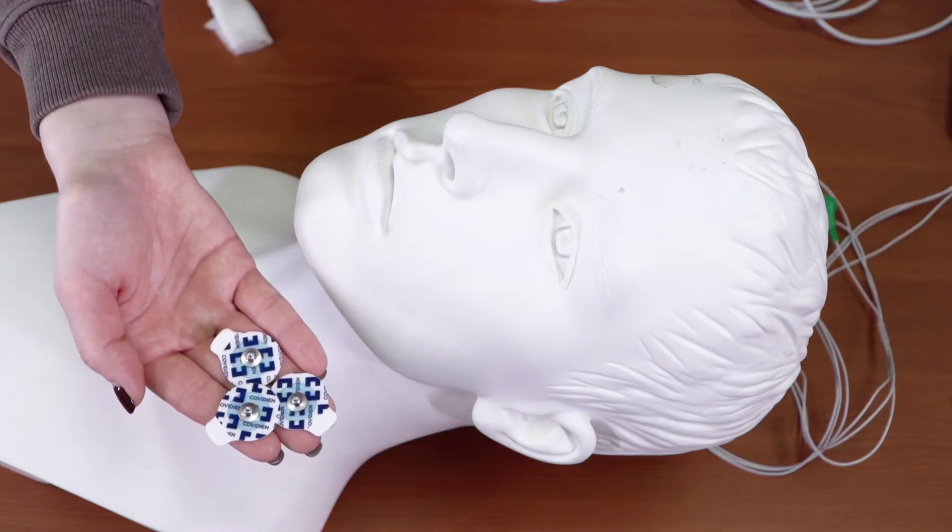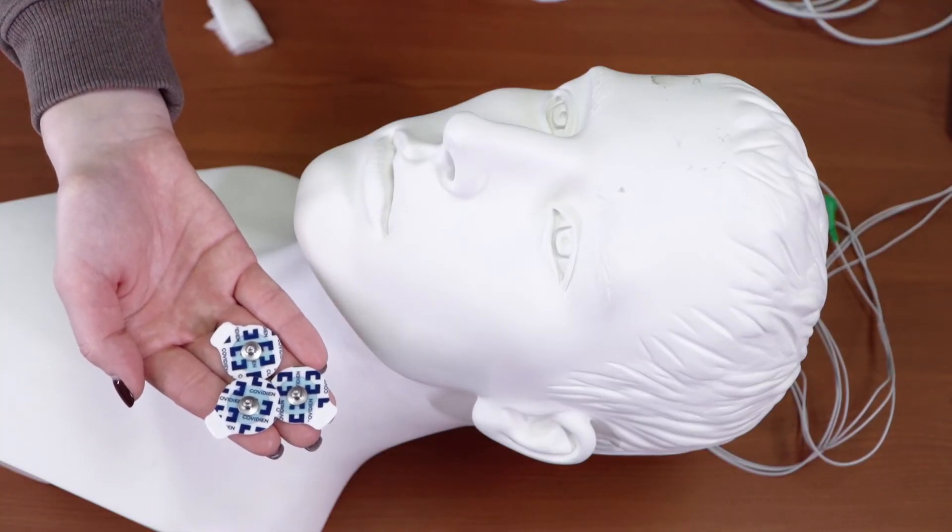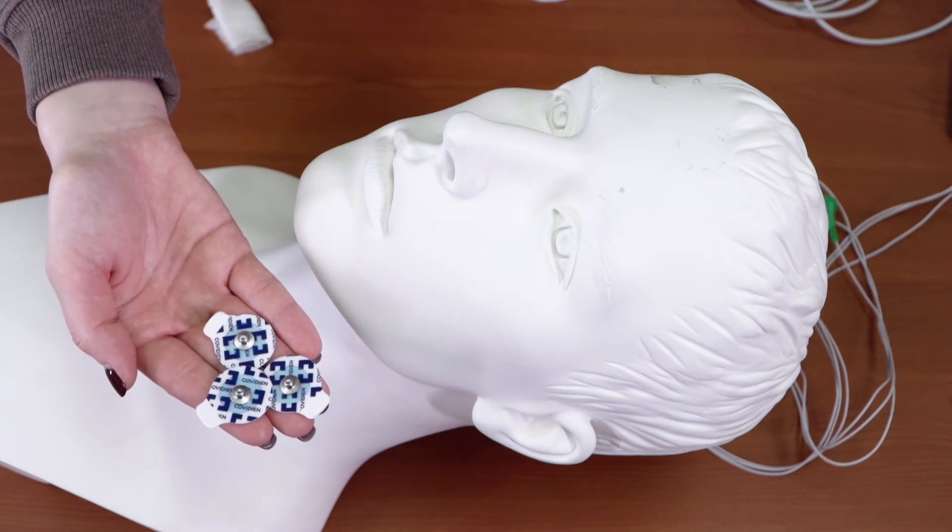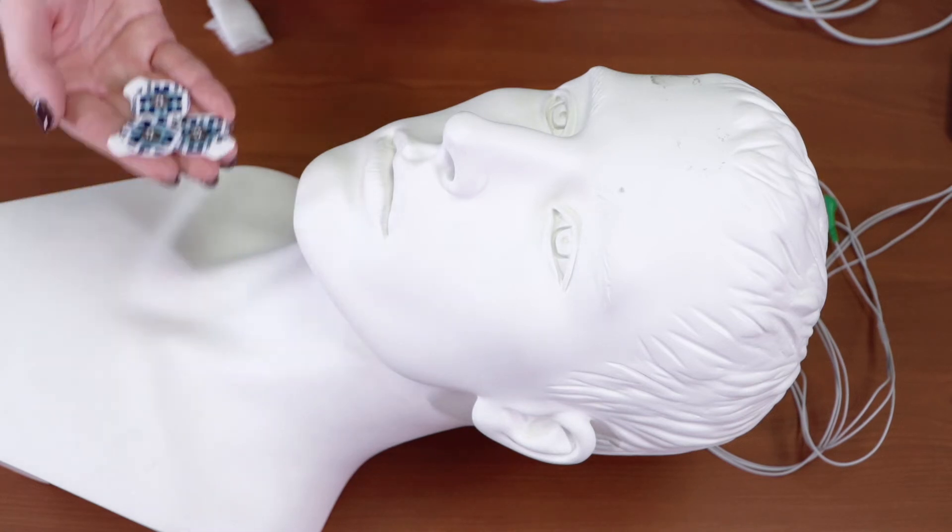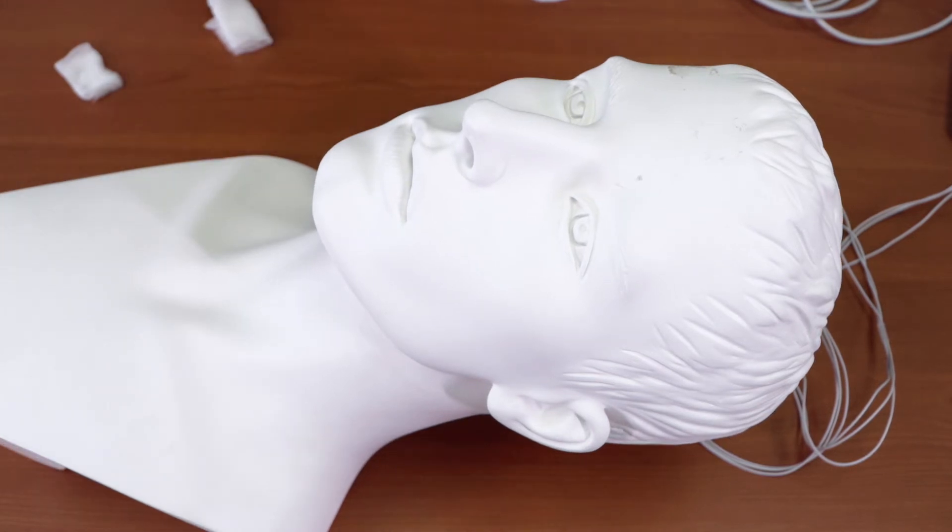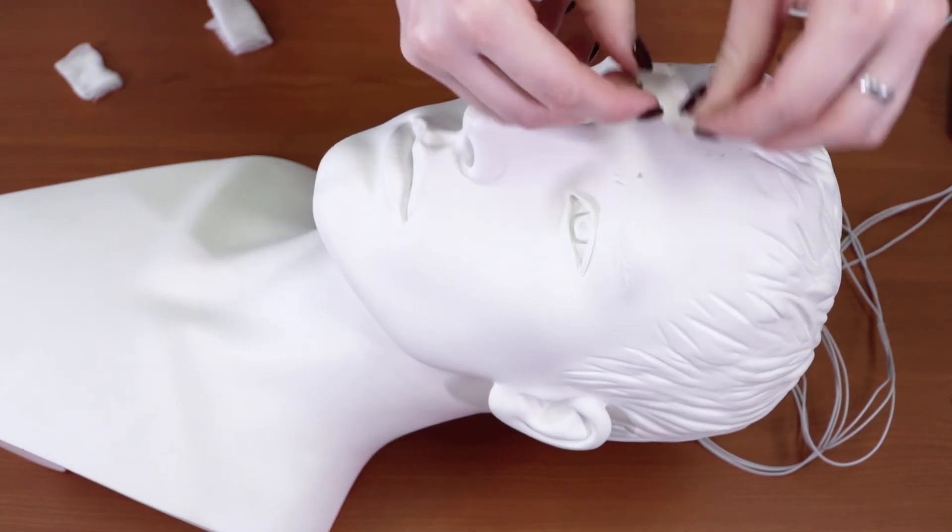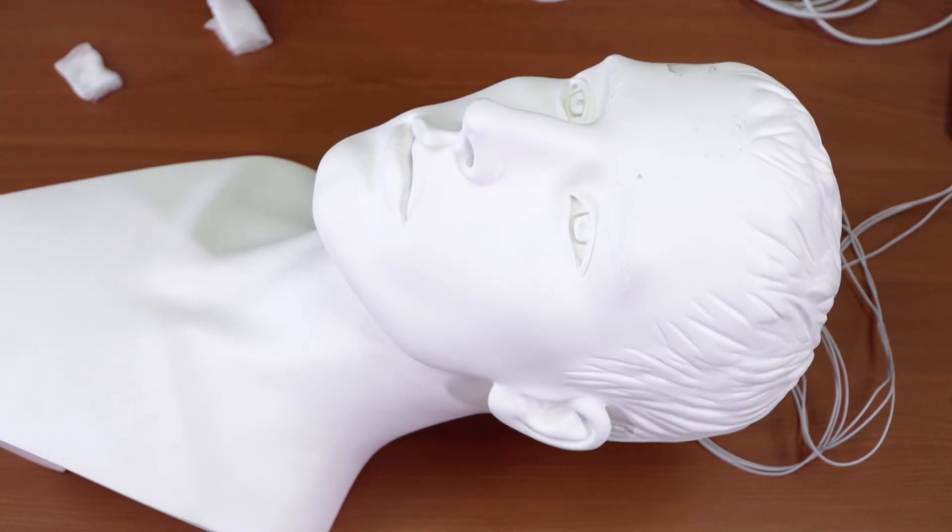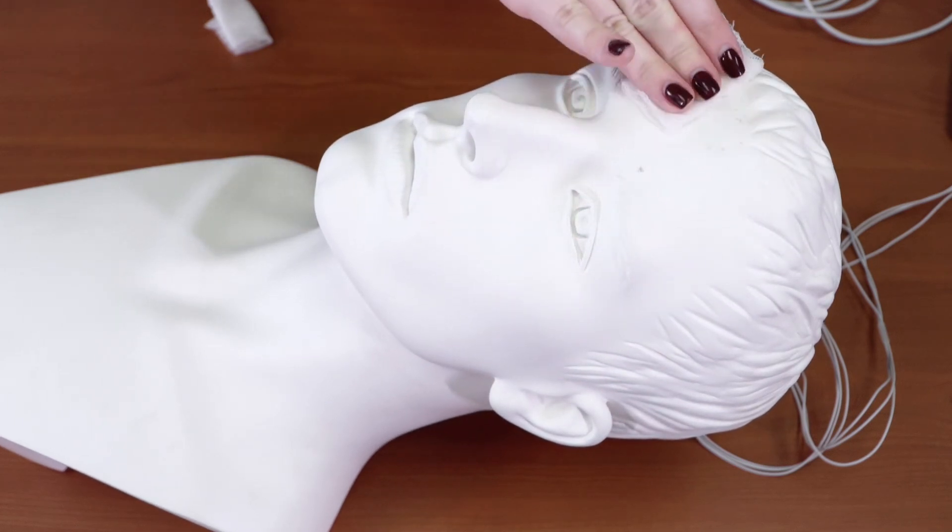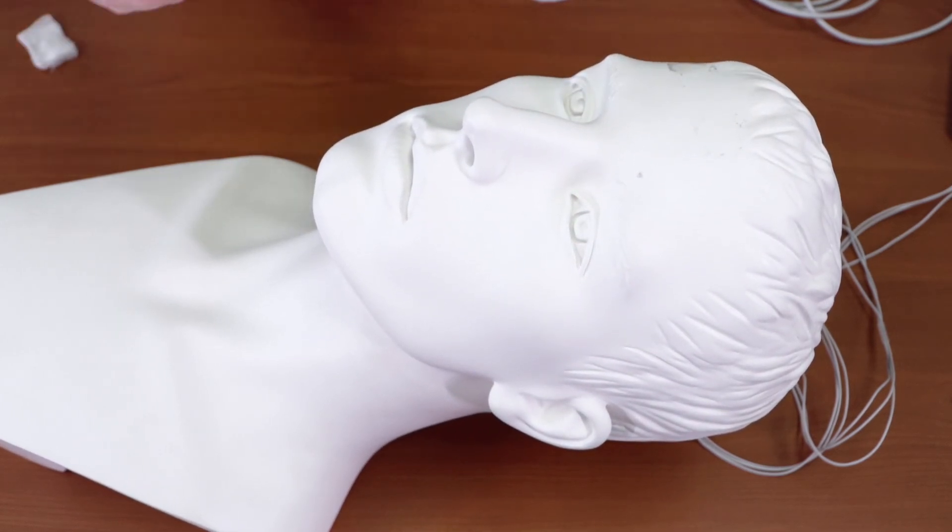The MGA-06 monitor uses pediatric ECG electrodes for measurement of potential. It is more affordable than tape electrodes. For good contact of electrodes you need to prepare the patient skin. Remove upper layer of epidermis. You can stick and unstick the adhesive plaster several times. Carefully wipe the skin with ethanol wetted tampon and dry it with a tampon.